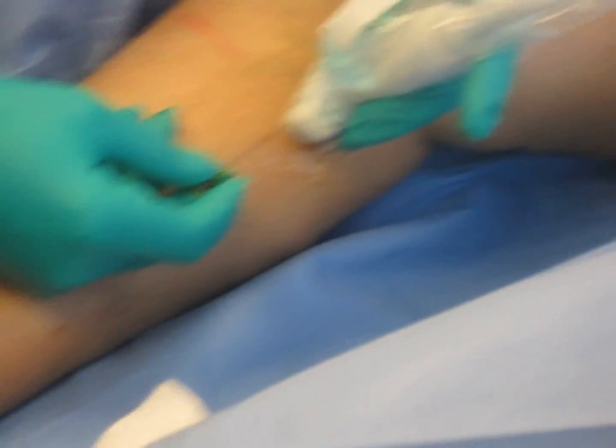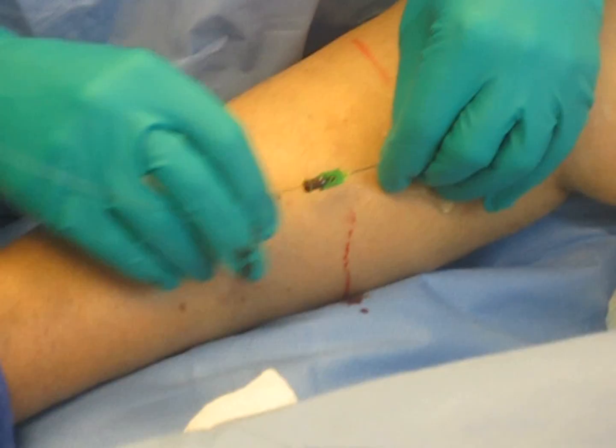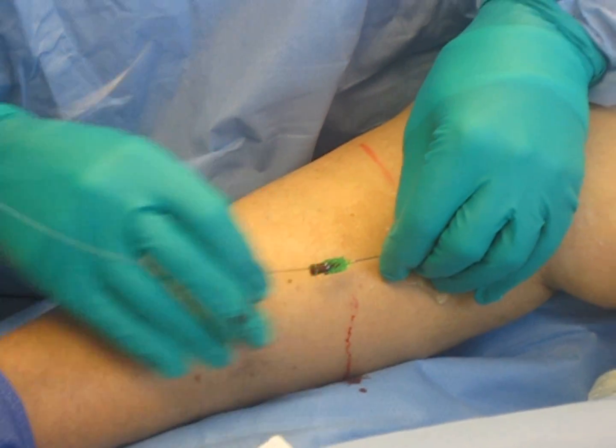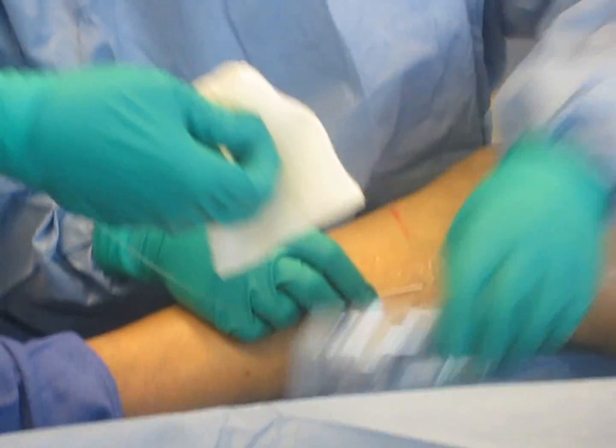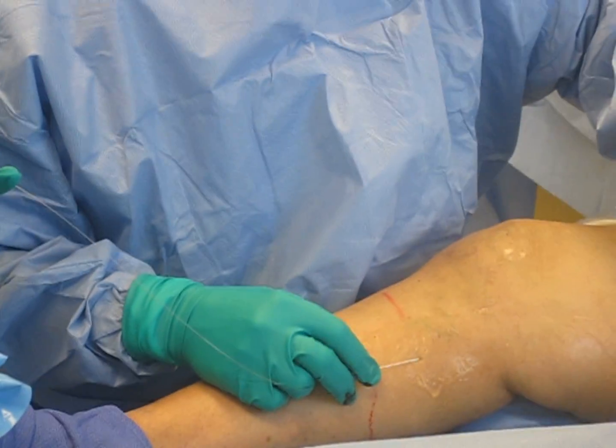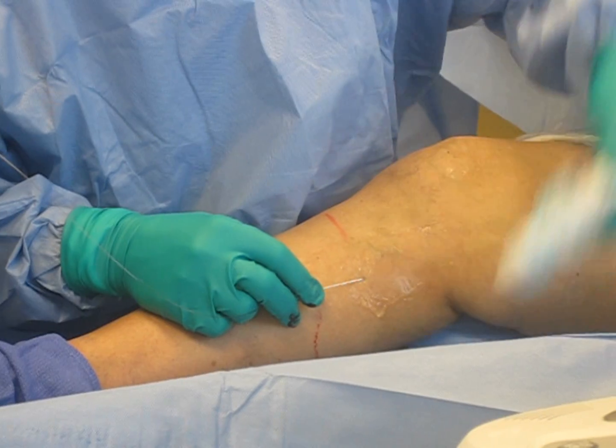If you can see on the picture on the screen, we've accessed her vein right there. You can see me wiggling the point of the needle, and you're going to see the guide wire come out of that needle and we're going to move it up the vein. The vein's a little tender — sometimes when patients have been standing when they come in for the procedure, the vein's a little tender.